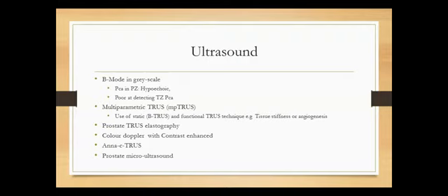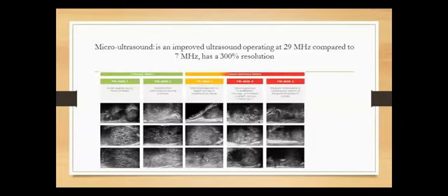The latest development is the prostate micro ultrasound, which I'll go into a bit now. So as said before, it has a 29 megahertz.